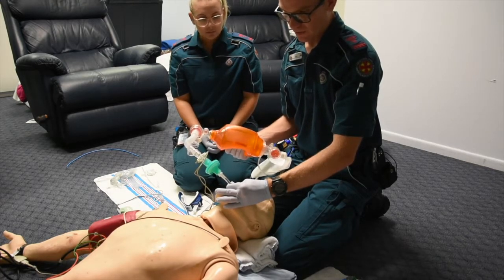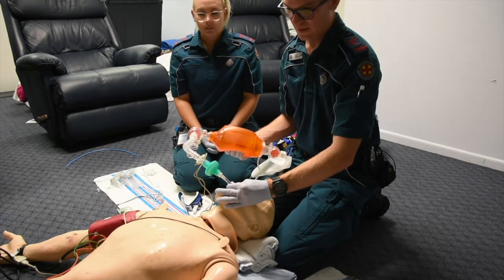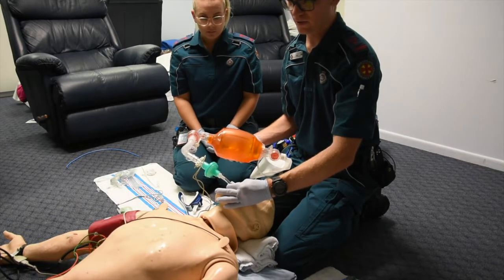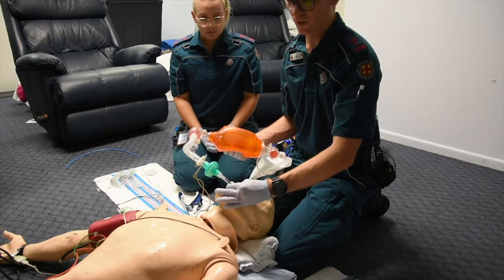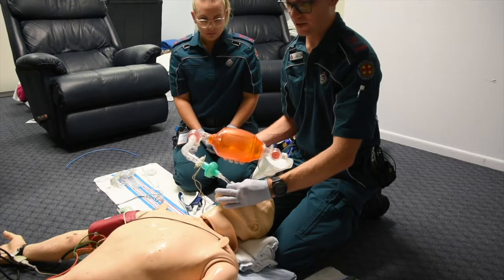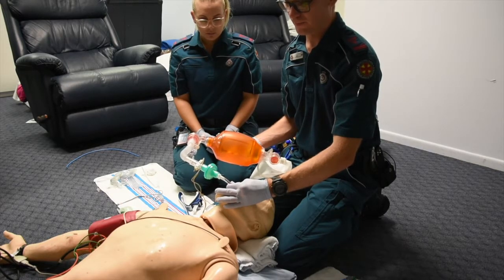So looking at the rise and fall of the chest, I want equal rise and fall of the chest, and I'm also going to be listening for chest sounds. So that's bilaterally, and to make sure that I've got sound everywhere. If I only heard it on one side in particular, predominantly the right, I might have a right main bronchus intubation, and that would have to be pulled out a little bit.